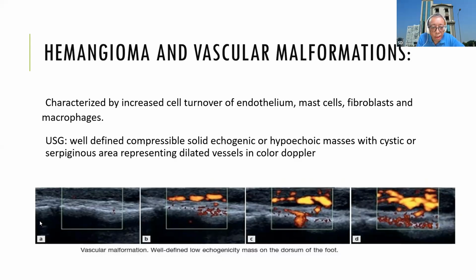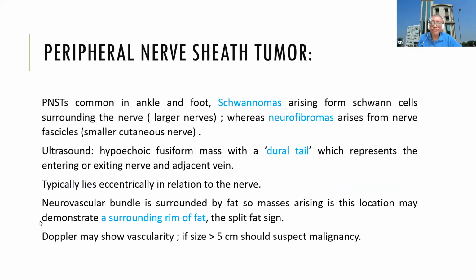So this is also a red flag. Once we identify hemangioma and vascular malformation, we usually refer the patient, but diagnosis is the key feature. As we are using ultrasound, it is easier for us to diagnose and send the patient to the relevant department for further management.